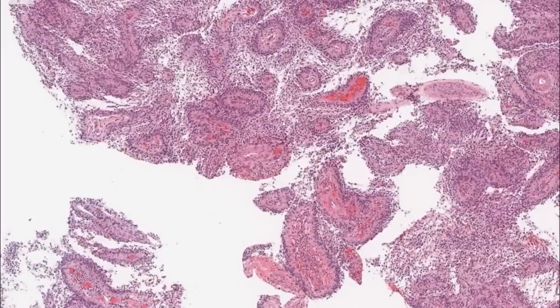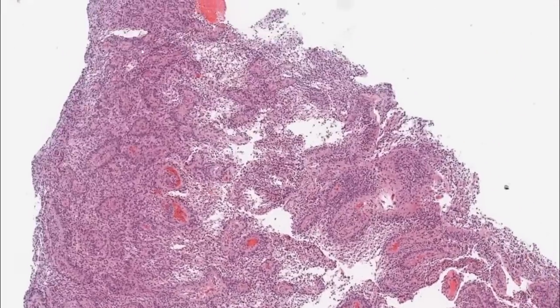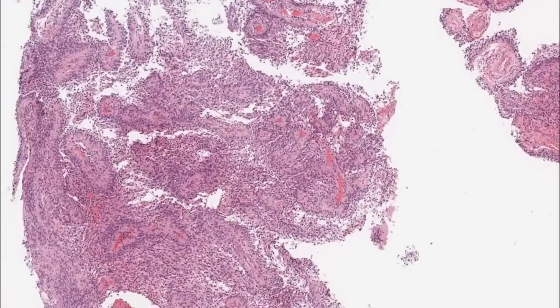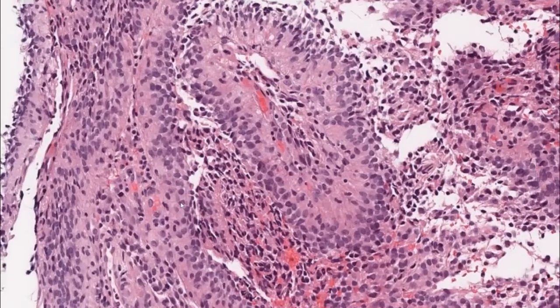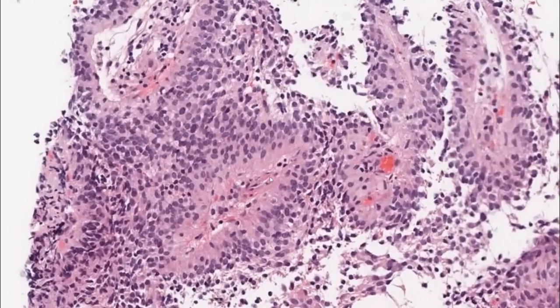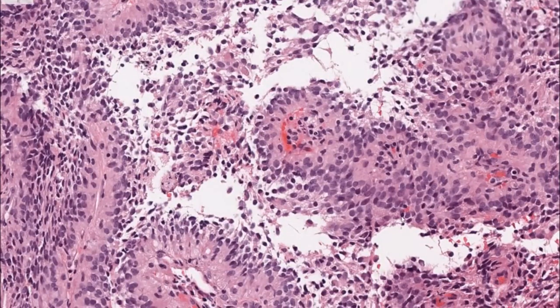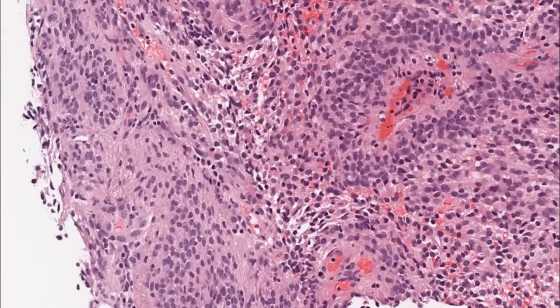You see at a low power, and again, you see a theme. You have these pseudorosettes, and here actually the tumor is breaking down almost in pseudopapillae, very fragile pieces. Now, in here, if you go on the high power, you do see the pseudorosettes, and they are very conspicuous at low power, right? But you see the cell processes that are a little bit broader. That's how we sometimes term these. The cells are a little plumper, and the processes are broader. You don't have those fine, almost fibrillary-looking cell processes in this case.